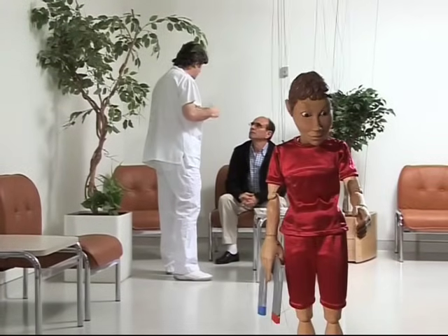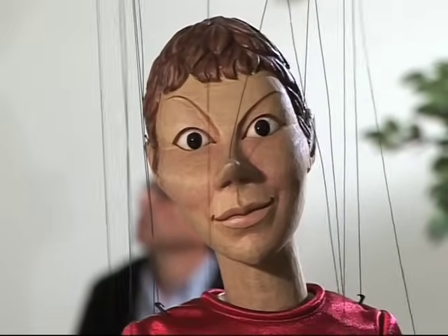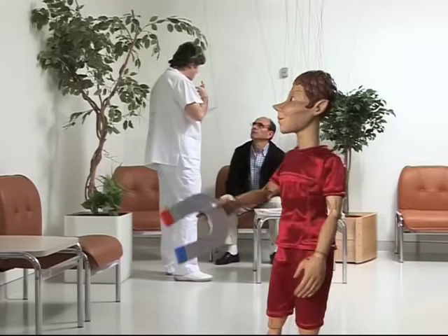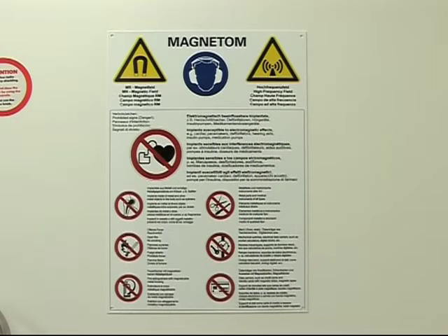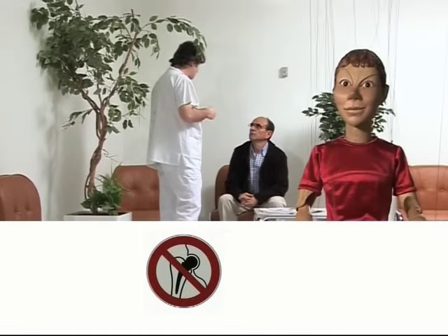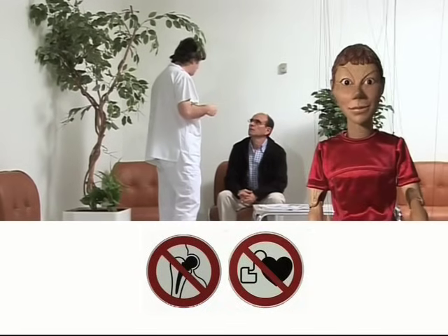Please be reassured this scan is not dangerous. Nonetheless, we must be careful because of the magnetic field. You know that magnets attract metal, so we should watch out for metallic objects. This is why your radiology technician will ask you if you have any metallic objects inside your body, like prosthesis, pins, metal fragments, or a pacemaker — you know, a heart battery.